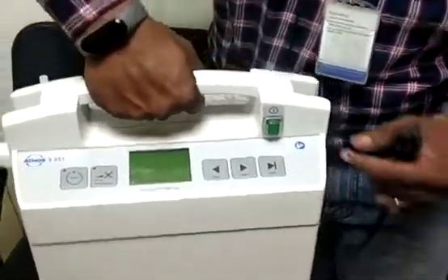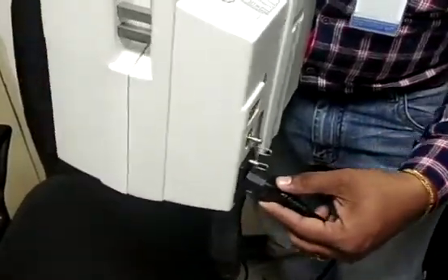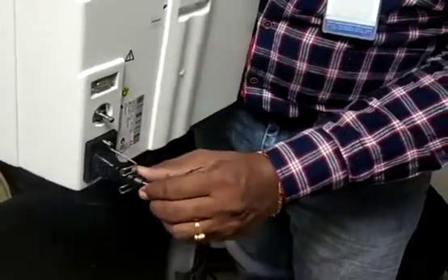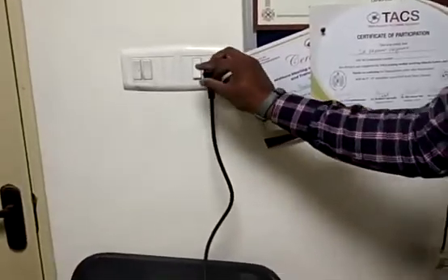This is the S351 section model. On the back side, you are going to connect the power cord. Simply connect the power cord here, then lock this power cord. Next, simply connect this power cord to the power socket. So now it's ready.